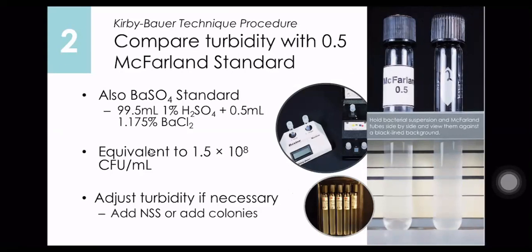Your McFarland standard has the component. Tandaan nyo ang combo nga ni the 1% sulfuric acid plus 1.175 barium chloride. Tandaan nyo, the McFarland standard or barium sulfate standard is composed of 1% lang na sulfuric acid plus 1.175 barium chloride. Plus, tandaan pagid ang ml or volume sang kada isa ka component.